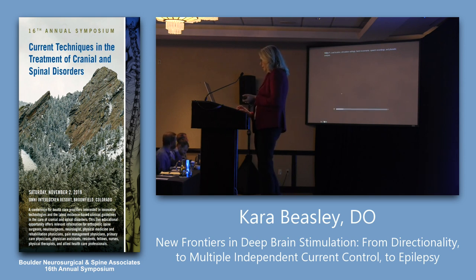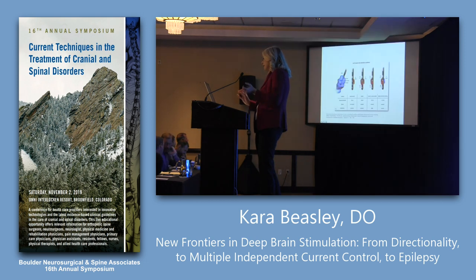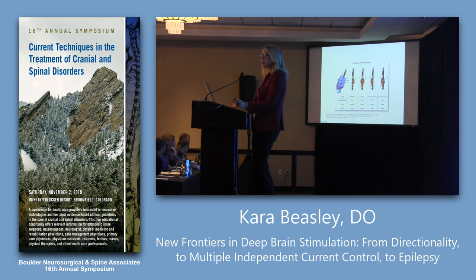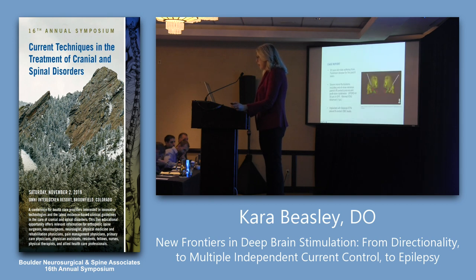Is it still going? It's not. It didn't play all the way. Anyhow, just to show you, I was hoping it was going to be all exciting: they were able to program away the dysarthria by using directionality, something they couldn't have done in ring mode. It compared ring mode to directional and the dysarthria that occurred, which was super exciting.